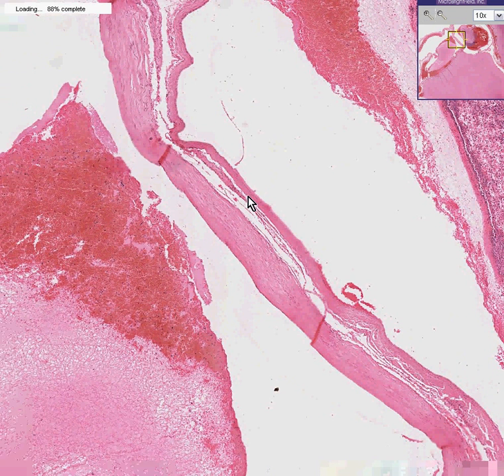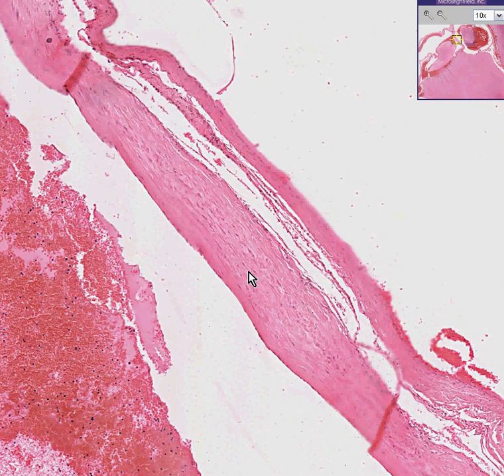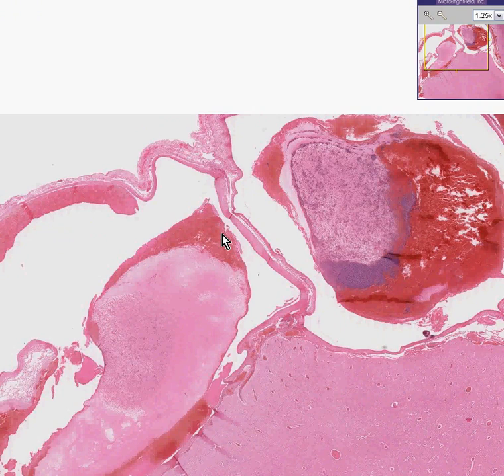So I would imagine that the veins might have to react by forming thicker walls, and if these arteries are losing some of that pressure because of direct communication with veins, maybe their wall wouldn't be as thick, and maybe the lumen wouldn't be as small either. I can't tell you for sure this is the wall of an artery and that's the wall of a vein, but it'd be a good guess. And in the AVM, you basically have a lot of blood clots and blood mixed in a tangle of vascular lined spaces.